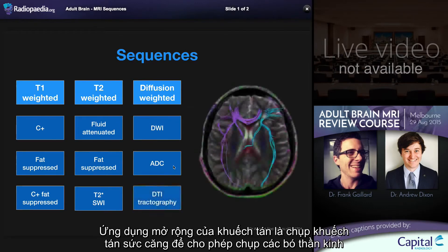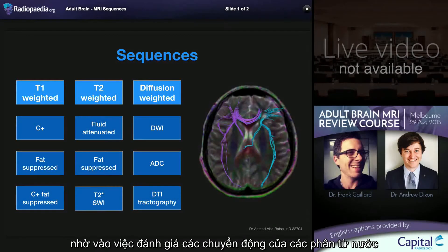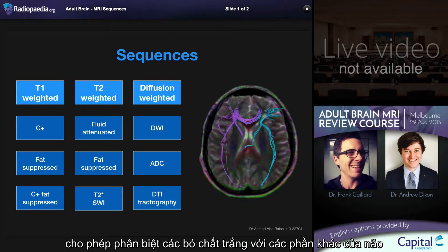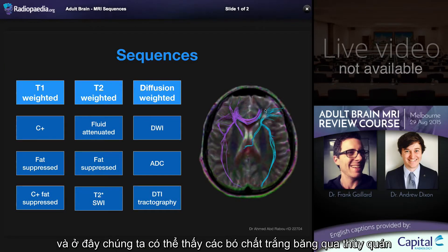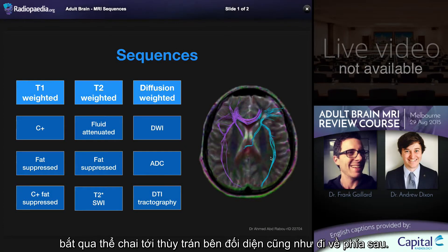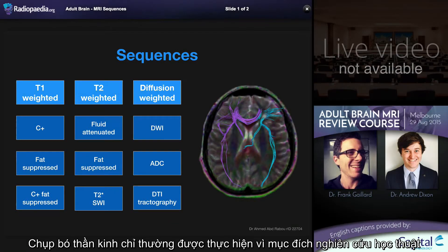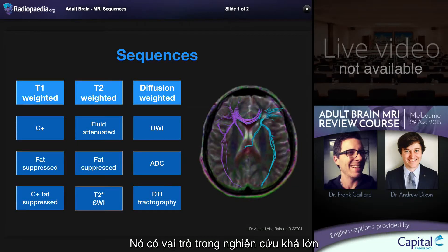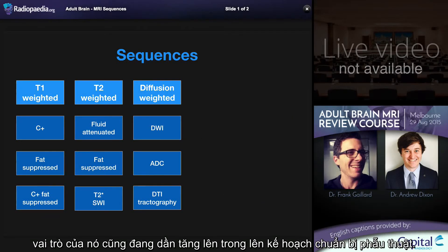An extension of diffusion is diffusion tensor imaging, which allows tractography, whereby the fact that water molecule motion is restricted along white matter tracks enables the tracking of white matter tracks from one part of the brain to another. Here we can see white matter tracks crossing from one frontal lobe across the corpus callosum to the other frontal lobe, as well as extending posteriorly. Although tractography is relatively frequently performed in academic institutions, its role is largely research-based, but it is finding increasing roles in operative planning.